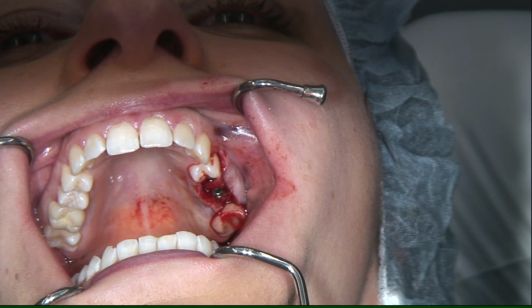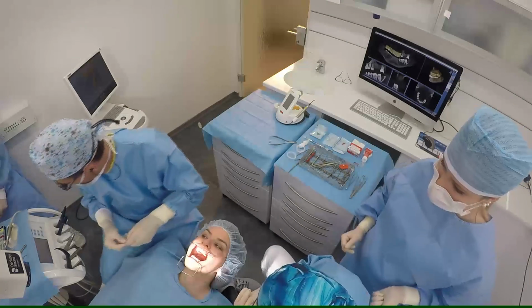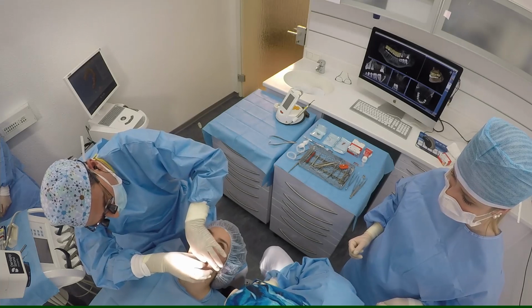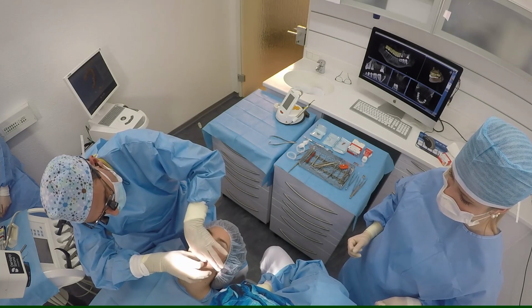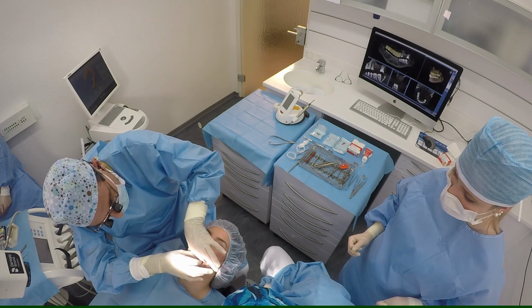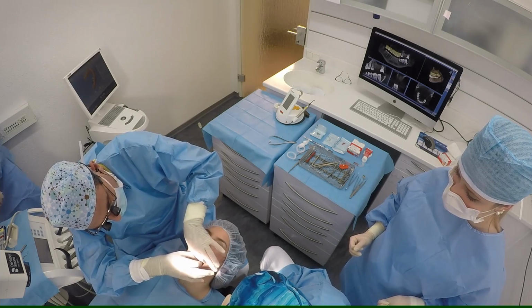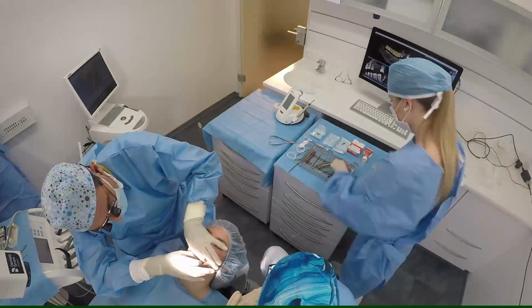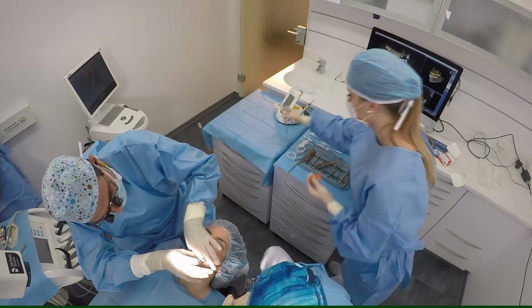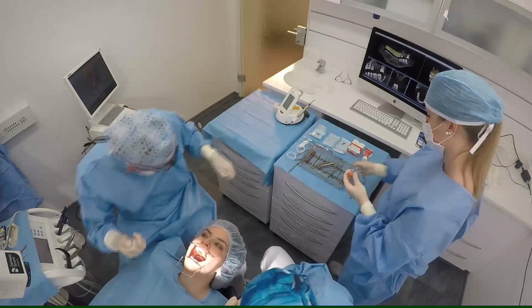So around the implant, studies from Krunda recommend 2 millimeters of bone around the implant to avoid bone resorption. But that was planned already in advance with a CBCT scan according to the backward planning concept.